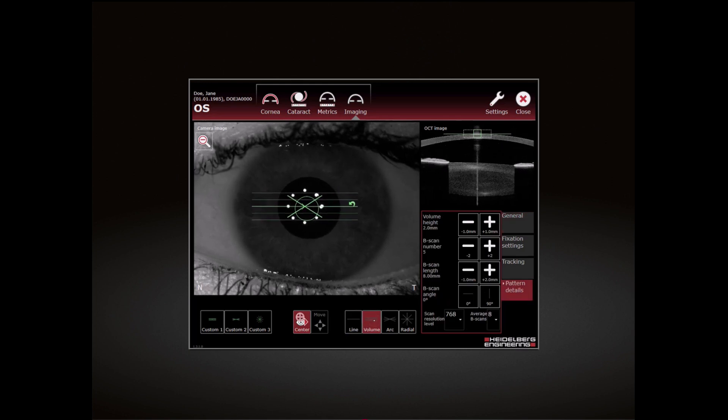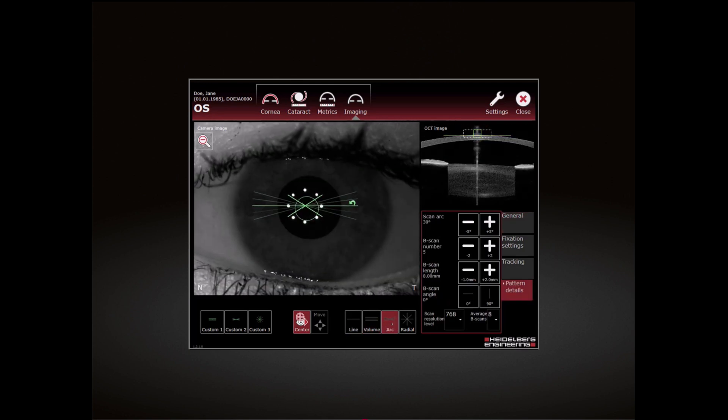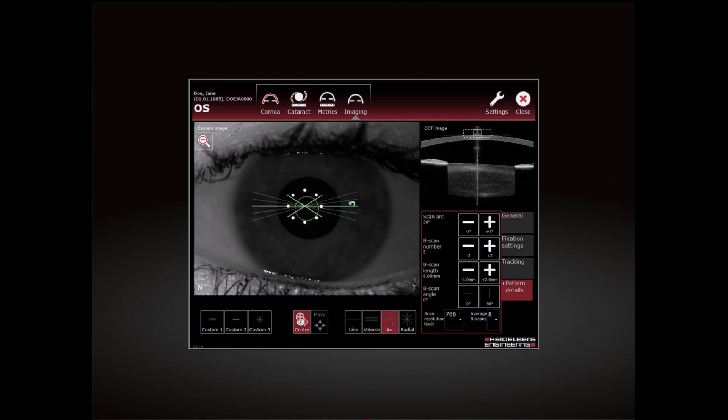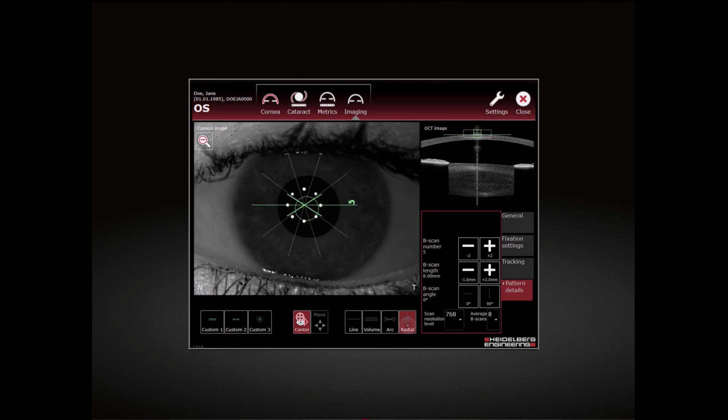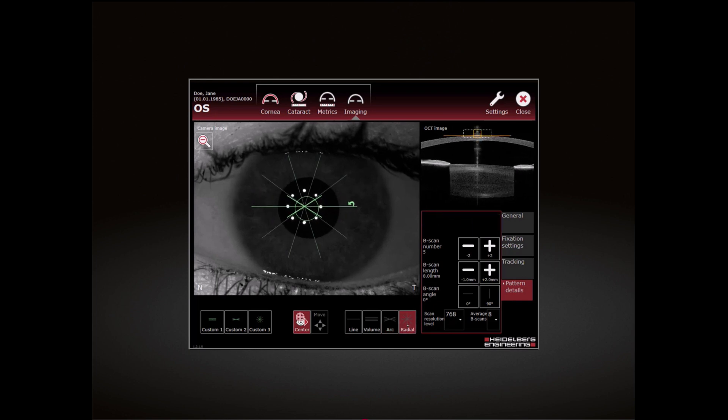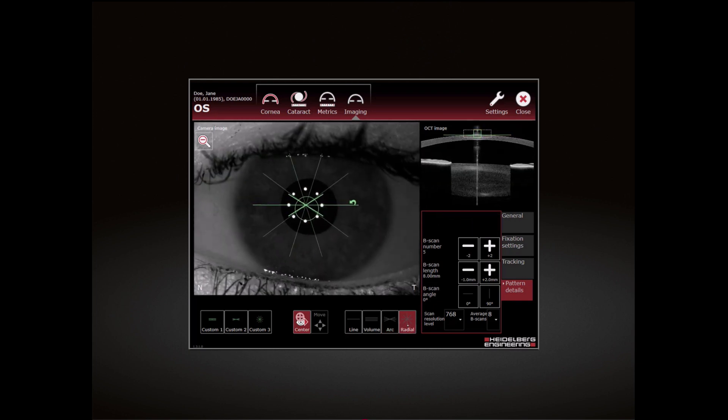Choose between Line, Volume, Arc and Radial Scan Pattern.